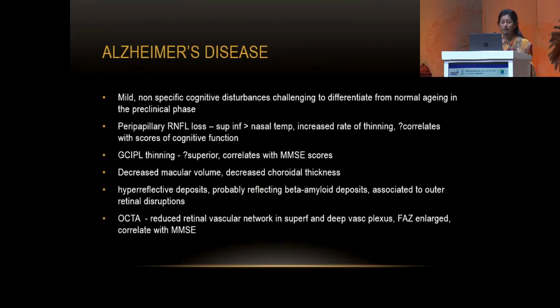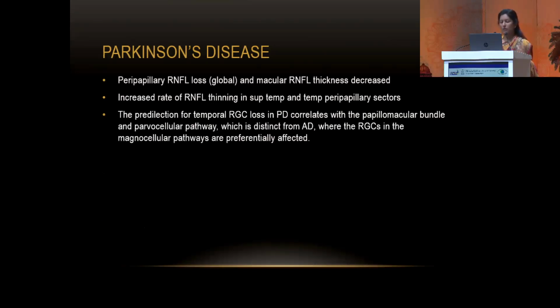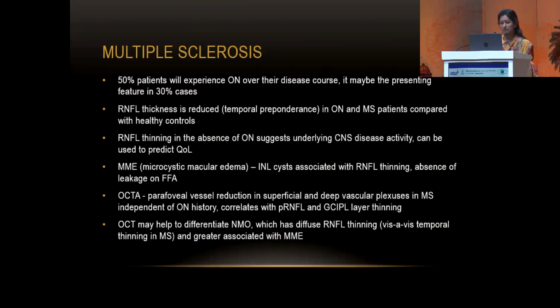So OCTA has also been used to quantify the retinal vascular network in the deep and superficial plexus, and it has been seen that the FAZ is enlarged. Interestingly, this correlates with the Mini-Mental State Examination, the MMSE. So really we need to work in conjunction with our neurology departments even more.